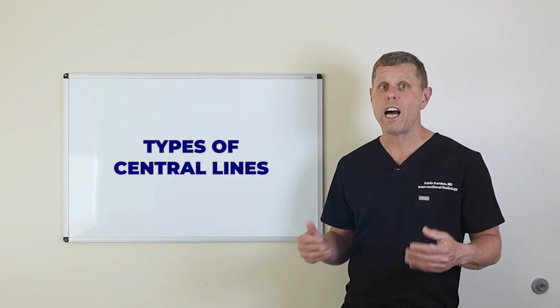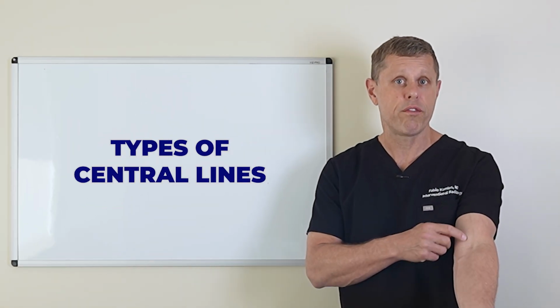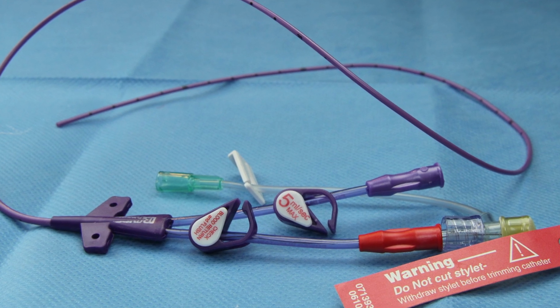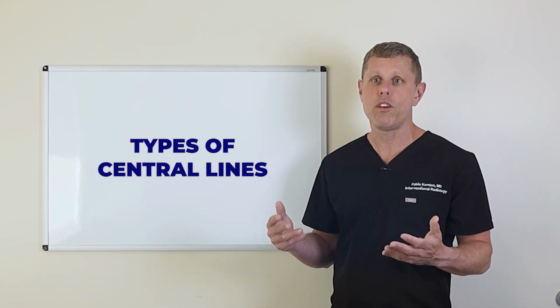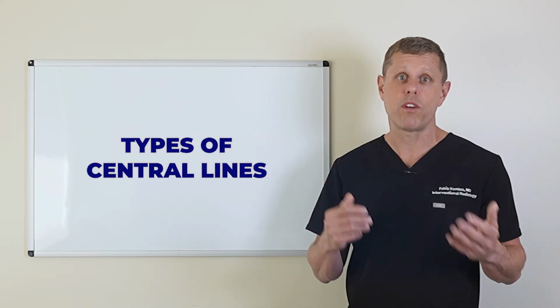Now, there's also another type of non-tunneled central line that is inserted through a peripheral vein in the arm. That's called a PICC line. They're probably the most common lines that patients may have in the hospital. If you were hospitalized for a certain period of time, you likely require to have a PICC line. And those are very useful for medications. They can be used for TPN, they can be used for antibiotics.